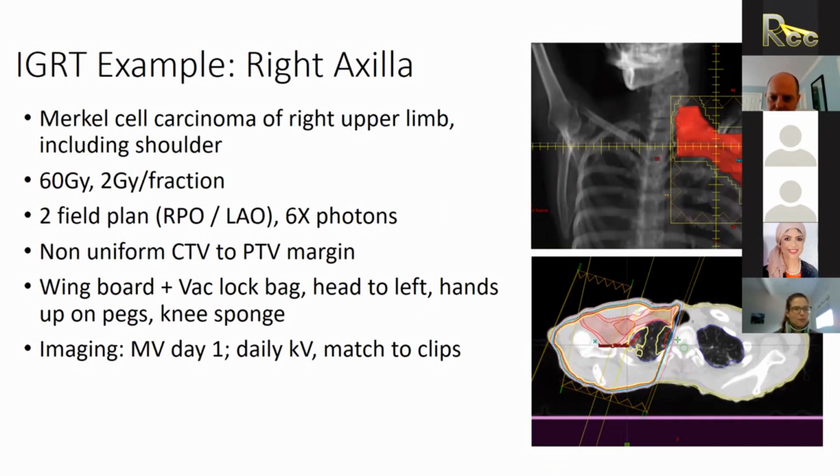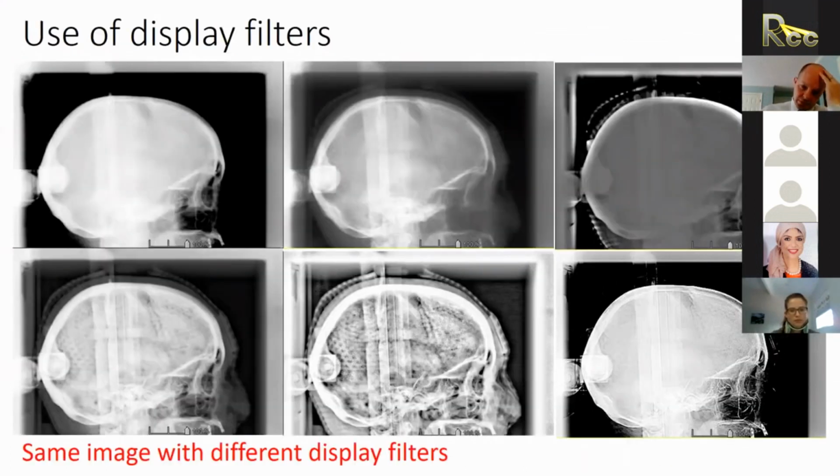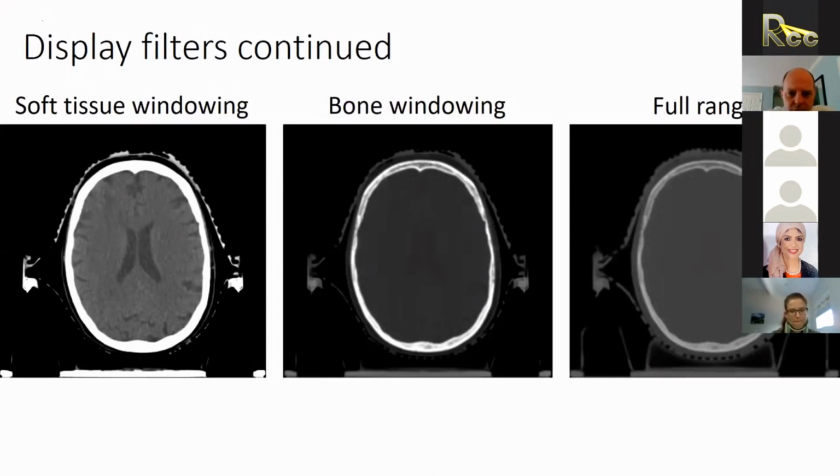Okay. There is a question from Mayeda. She is asking what the meaning of different filters is. Well, different filters means windows. Let's say I can say a bony window, which shows me the bone more, or a soft tissue window, which shows me the soft tissue more. The windows and filters, like what we said, bony window, soft tissue window, it's the same.